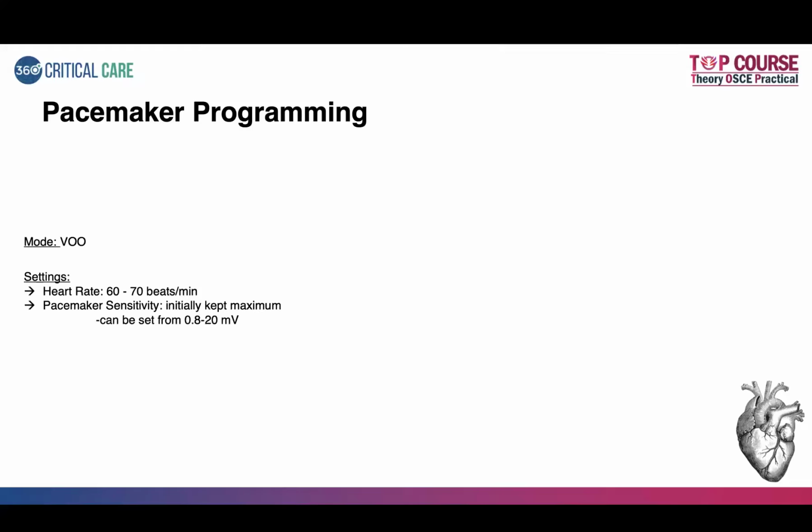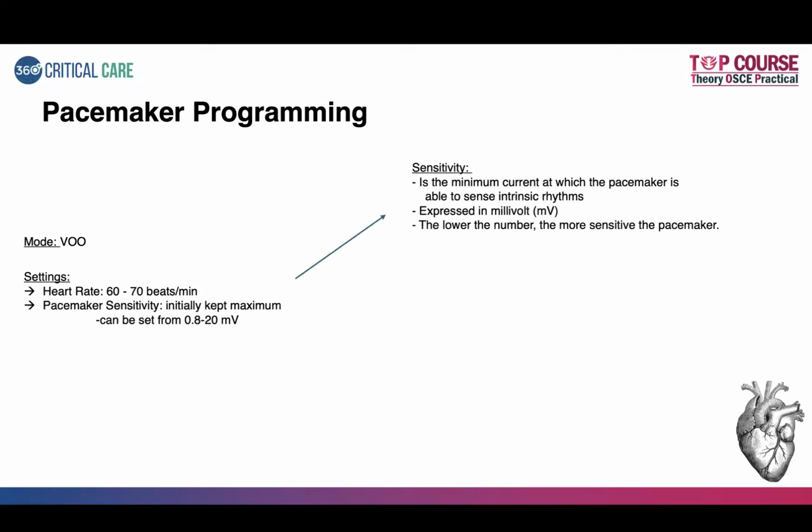Now, the important thing is, what is pacemaker sensitivity? It is the minimum current at which the pacemaker is able to sense intrinsic rhythms. I'm repeating it again: it is the minimum current at which the pacemaker is able to sense intrinsic rhythms, and it is expressed in millivolts. The important thing to note is, the lower the number, the more sensitive the pacemaker is. So it is hitting the tip adequately, and it is able to sense the intrinsic rhythms.